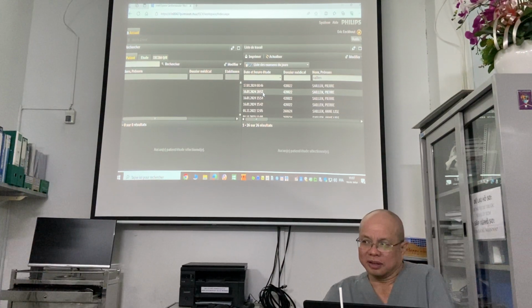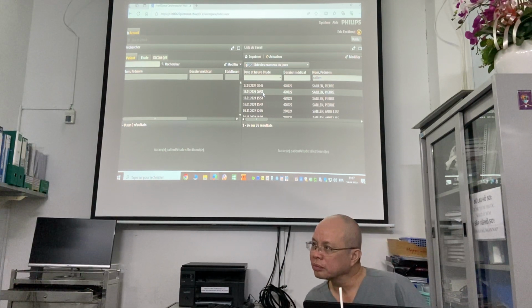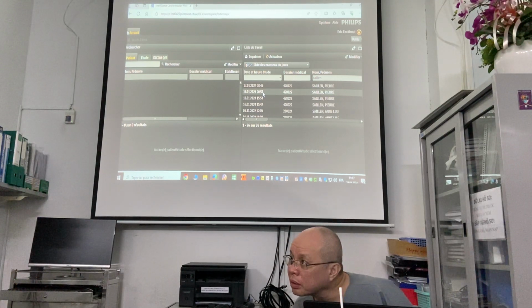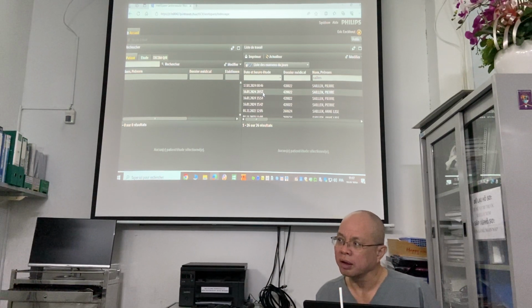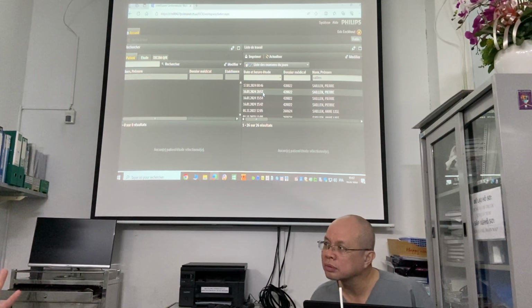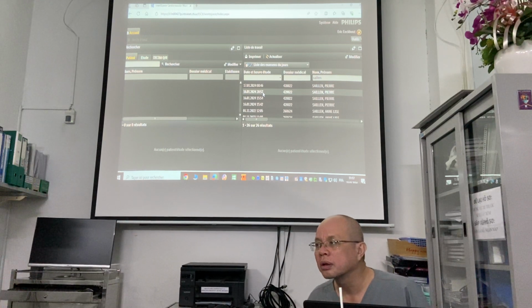So you prefer I do this, and then you really... I puncture, and my wire is going up. It's not going like this around the apex. I find it very strange, and it is blood. Blood is coming out. So I repuncture a second time. I'm not really sure. I repuncture a second time, and I see this time my wire is making the bend to the apex, so I say it's okay.